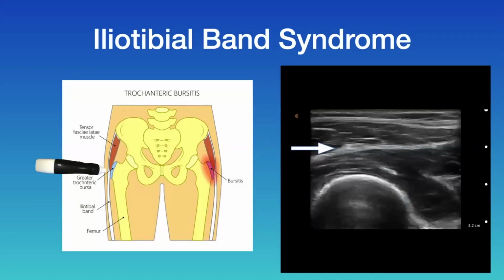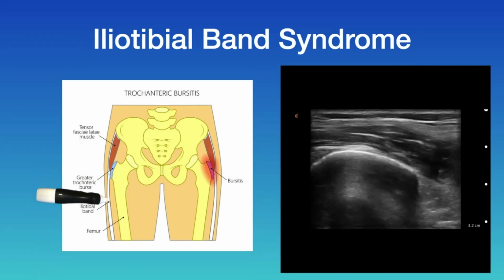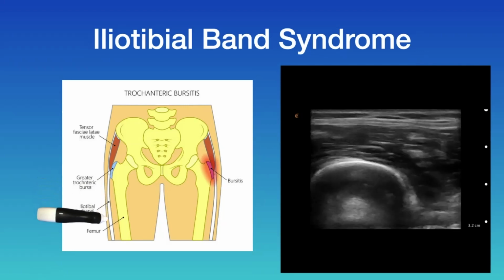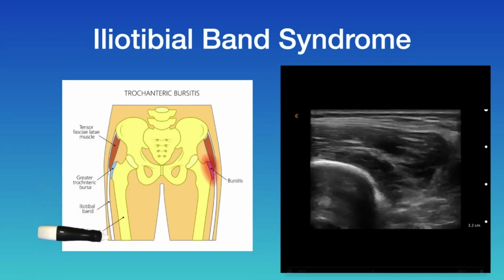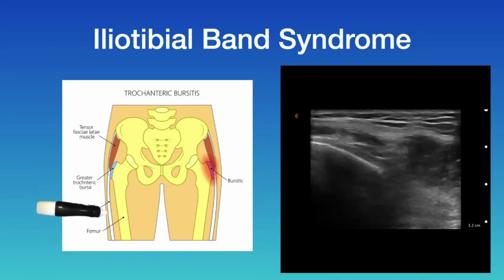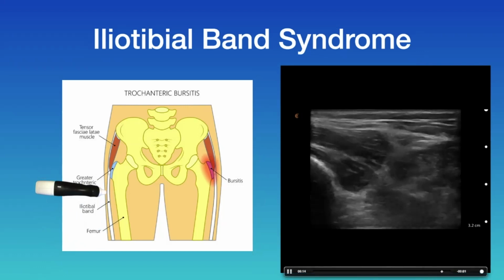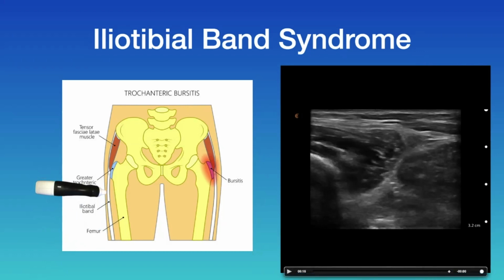And here I'm just running the probe along the iliotibial band up and down. The band is superficial, and it divides as you get lower, so there are deeper fibers closer to the knee, and then running back up the knee. Oftentimes, you're just injecting the white band above and below with a little bit of steroid and local anesthetic.